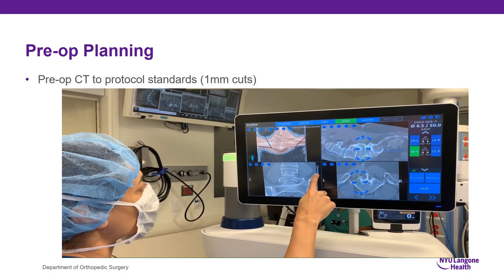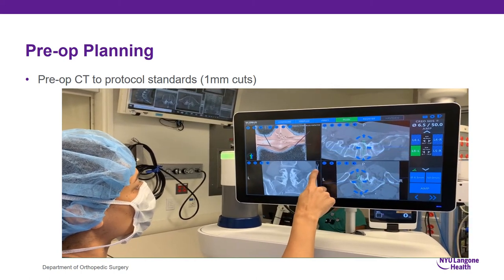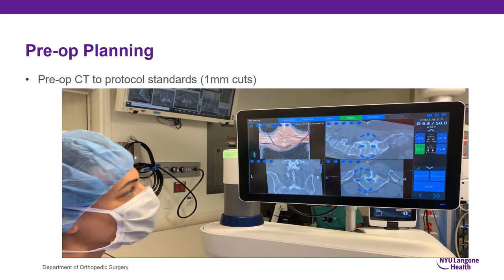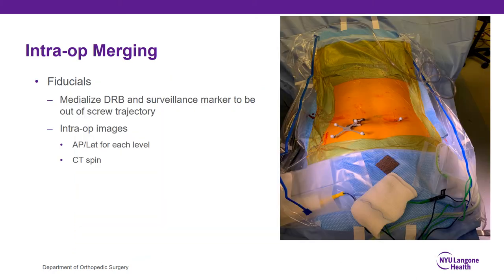Here I'm scrolling through the coronal bullseye view to make sure that the left L5 pedicle screw is within the pedicle the whole way. You can also see that the screw trajectories are very close to each other, so I'm going to have a very small incision. After the patient is prepped and draped, I want to place my fiducials, making sure they are out of the way of the screw trajectory while maintaining good line of sight with the reference camera.